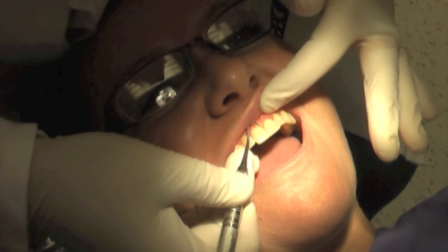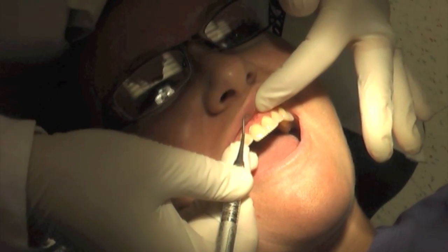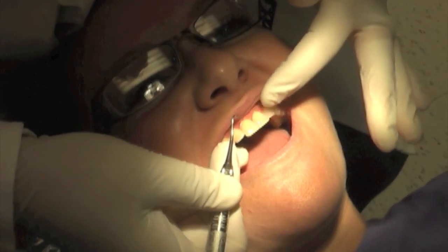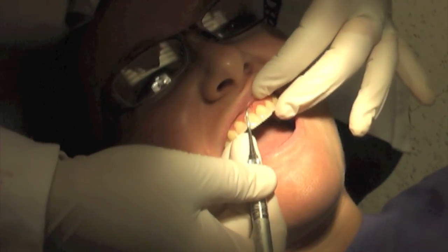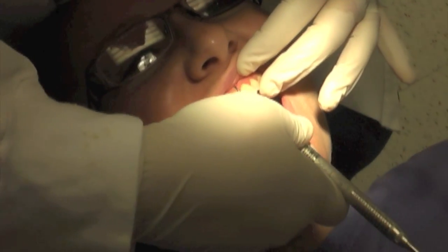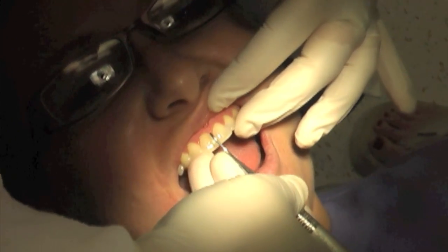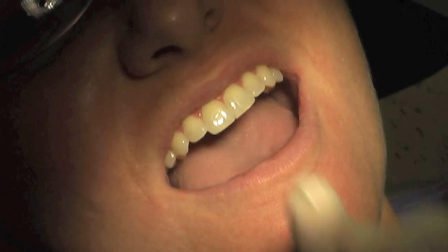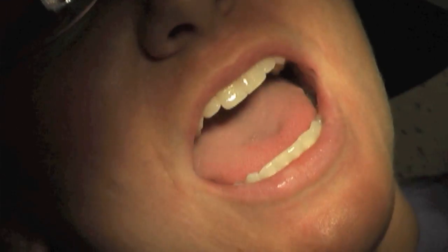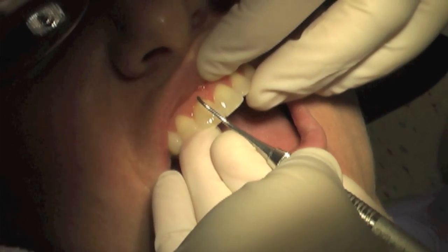Because if I'm going like this, I might get deposit just slightly under the gingiva, but what about the patient that has a piece right here? Marcy maybe isn't the best person to work with because she obviously has amazing gingiva, so she doesn't have a piece there. But you really want to lead with that toe. If you're going to get something out of a cookie jar, you're not going to lead in there with your knuckle and try to pick something up — you're going to go in with your finger and just scoop.